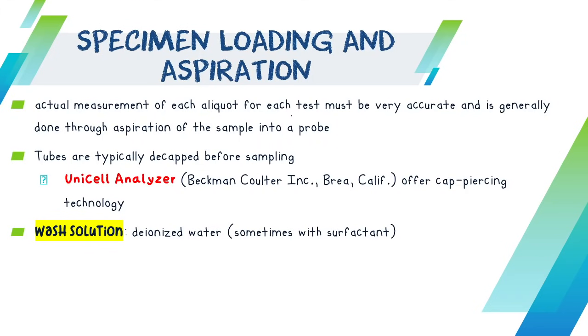So mao na naagi ning wash solution dapat kay this is actually for cleaning, especially your probes, to prevent and minimize carryover problems. So, mao na siya. Ang common man gyud nato na problem diri in the machines are carryover. Na it may carry over ang sample from one patient to the other, and that may lessen accuracy of our results. So that is why there is a need of cleaning gyud. Cleaning every now and then sa inyong machines, pero in terms of cleaning your probe, automatic na gyud na siya na part sa processing sa inyong machine.